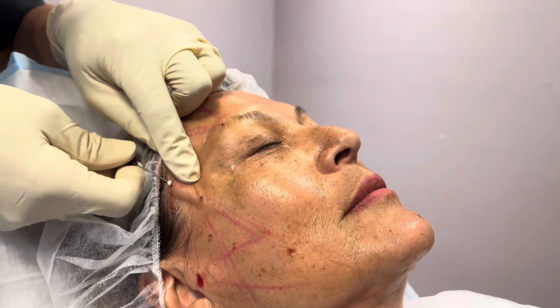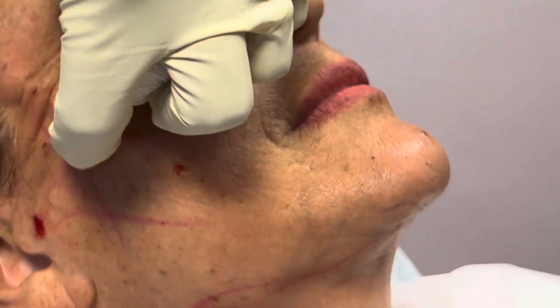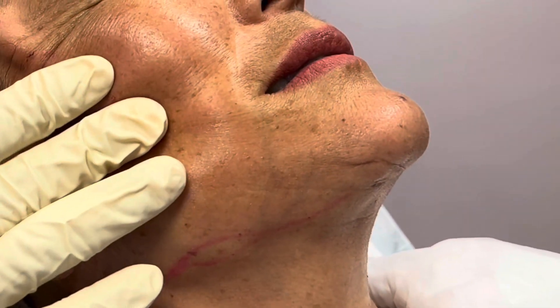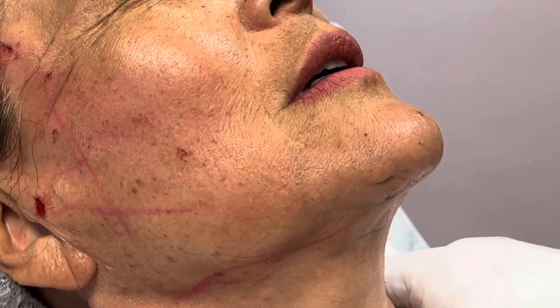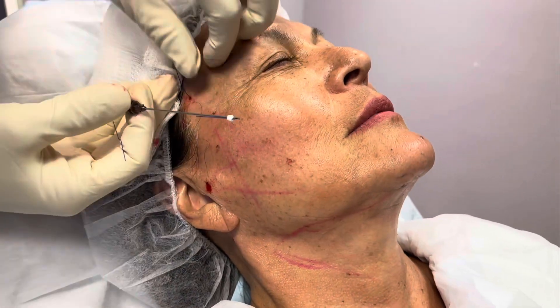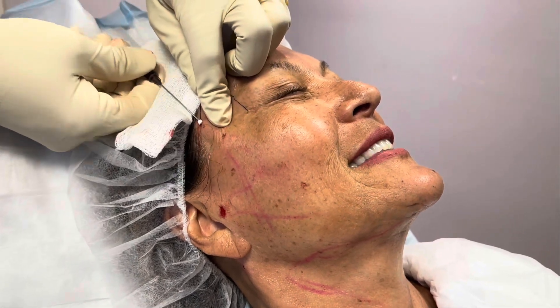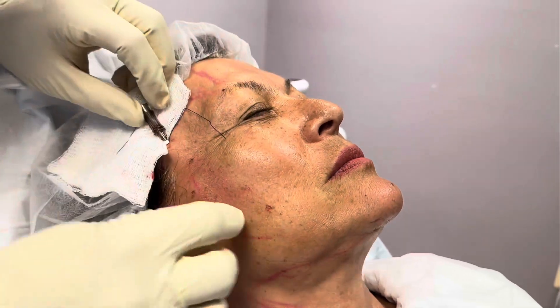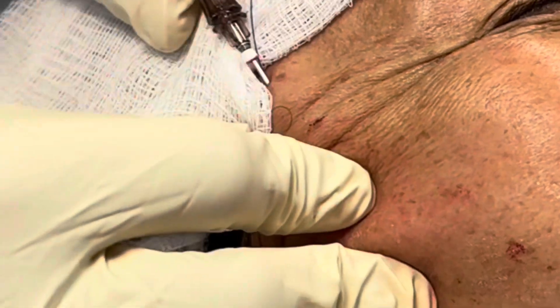Here's the cannula with the thread on it, and we're using it to insert the thread all the way down. When we pull the cannula out, the thread stays in and the end of the thread sticks out. We can then use that same port and go in a different direction. The cannula is blunt so it's not really hurting, plus we numbed the track already, so the patient is really not in any discomfort.